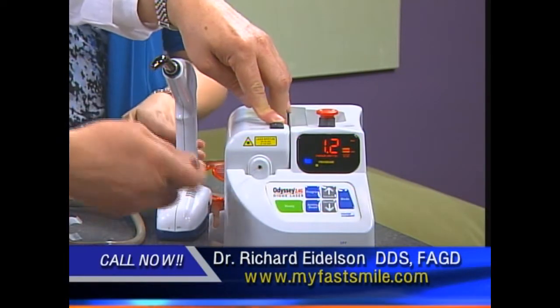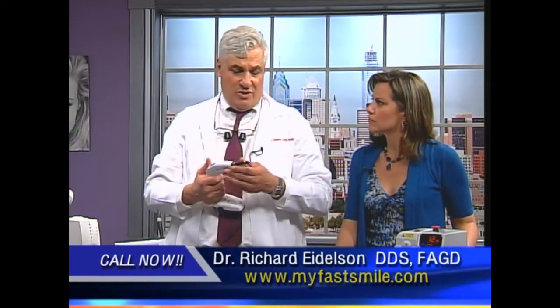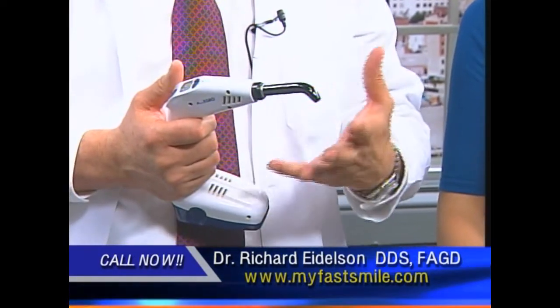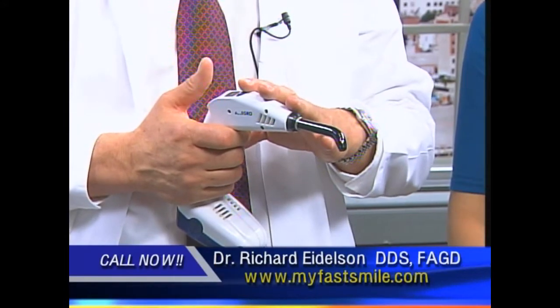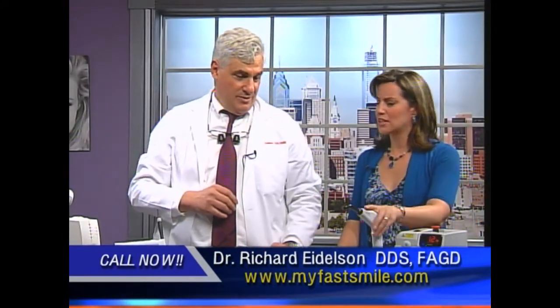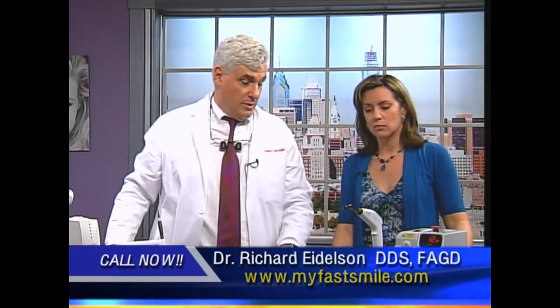And then we've got something right next to it as well. What's that? This is a bonding light. We do mostly the new white fillings, and this is an efficient way to set the material. Years ago, it used to take a long time to reconstruct multiple teeth, but this is a very fast light. It only takes 2 to 3 seconds to set. Wow. That's a huge time savings, I'm sure. Yes, when you're working all day, it makes a big difference. To the patient as well, I'm sure.